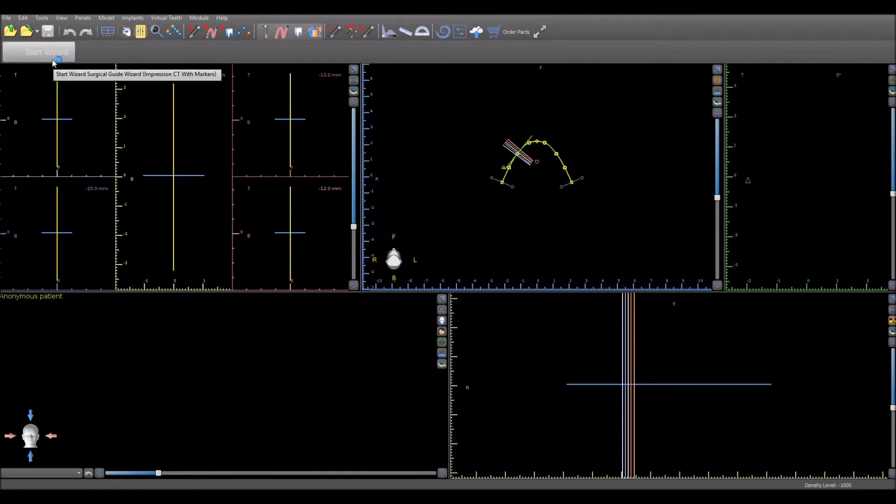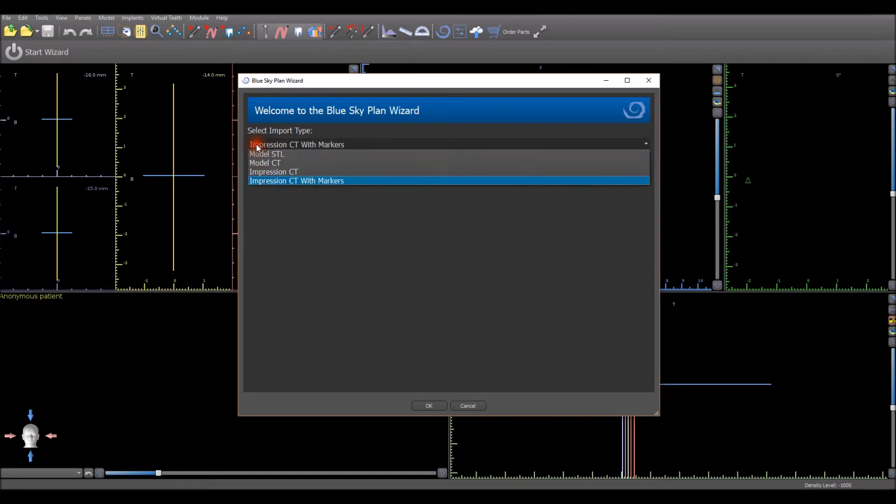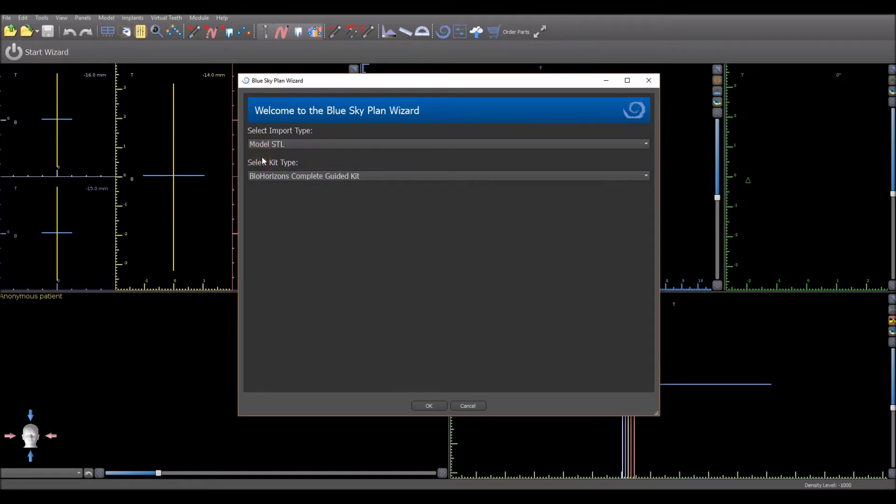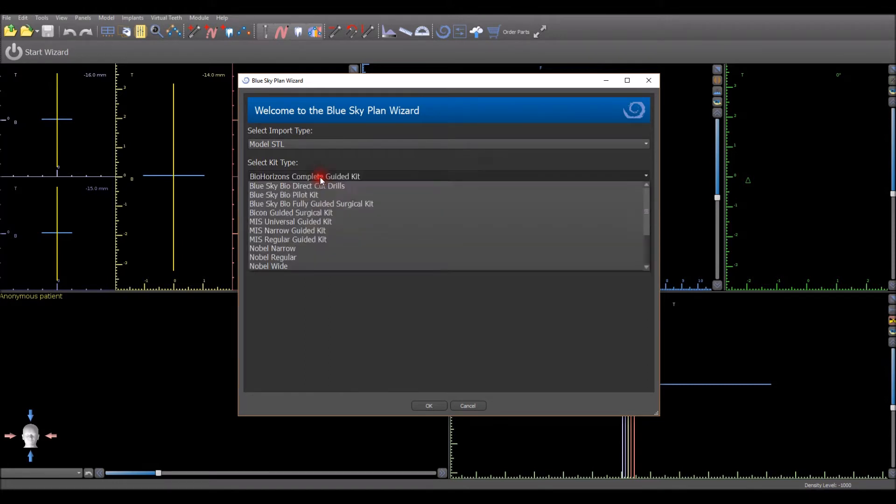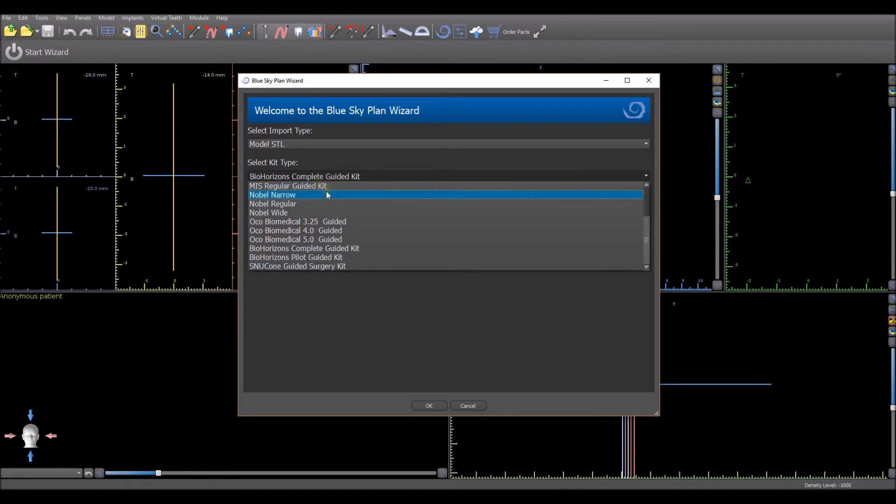When using the wizard, on the wizard intro screen, first select the import type and then left click on the select kit type drop down menu. Select the relevant guided surgical kit that will be used.